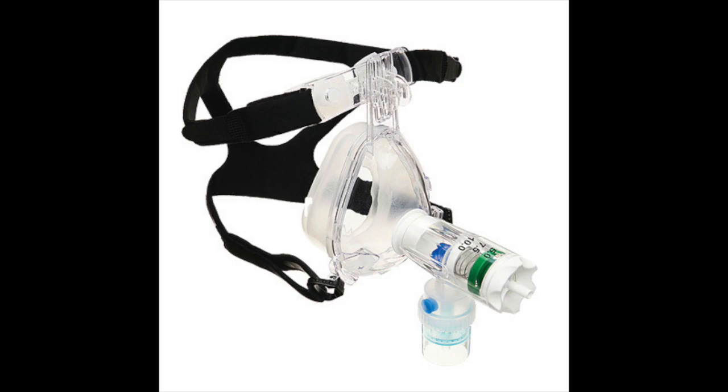And if you look at it, it's designed for the patient who is having trouble breathing because of fluid in their lungs, congestive heart failure, acute pulmonary edema. In some protocols, they'll use these for the asthmatic patients. And if you look at that device, you'll see on the nose of it, there's a little nebulizer that hooks up underneath so you can put albuterol or Atrovent in there. But look at the numbers, 5, 7.5, 10. That's the amount of centimeters of water you can set this device at.